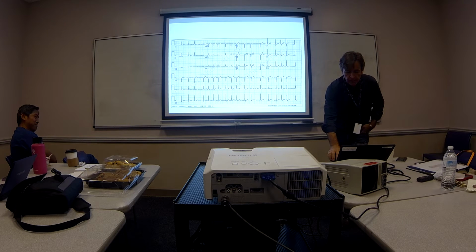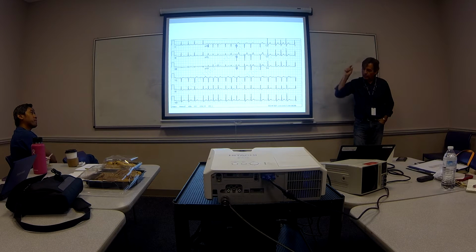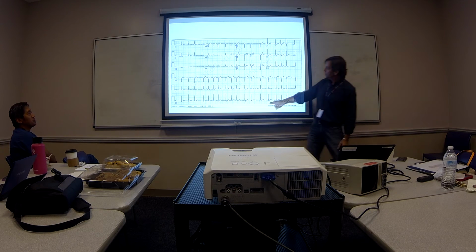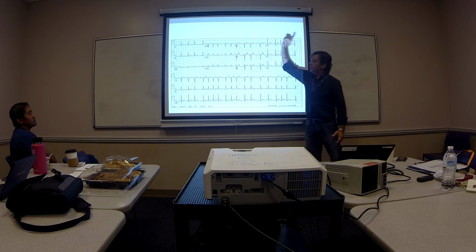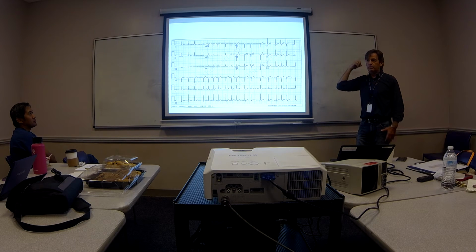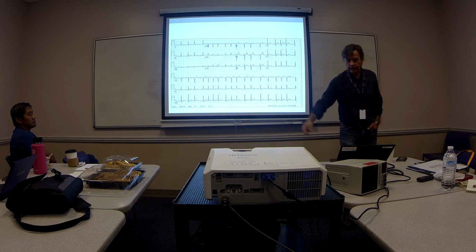So, unlike the atrial flutter, where the electricity runs rapidly in a circle in a very predictable fashion, atrial fibrillation is chaotic. I tell my patients, instead of 1 spark plug, the sinus node, you have 400 of them. And they go, oh my God. And they all fire off at the same time. So it gives you a complete chaotic atrial pattern, and this is why we see the wiggle line in the background. Again, the sinus node is trying, hey guys, 60, 70 beats a minute, but out there is chaos, right? Outside the sinus node. And the rate is fast and typically irregular.